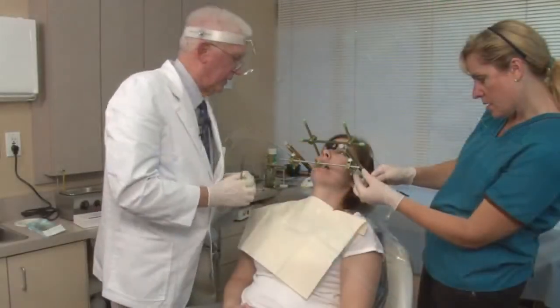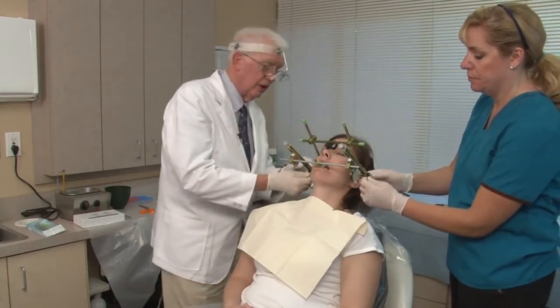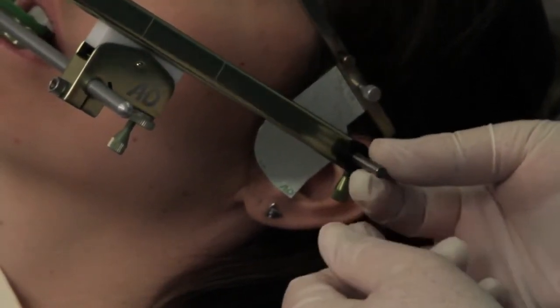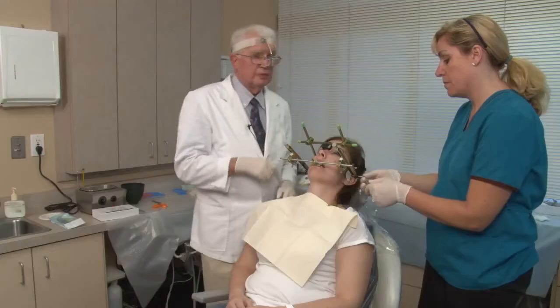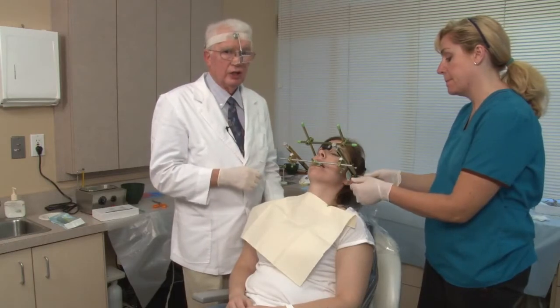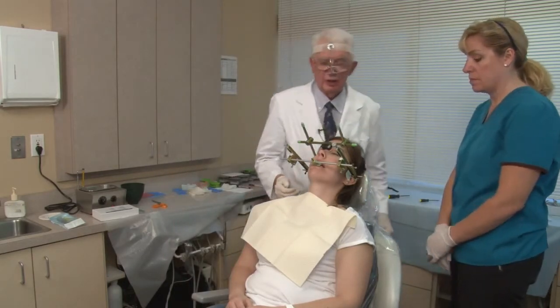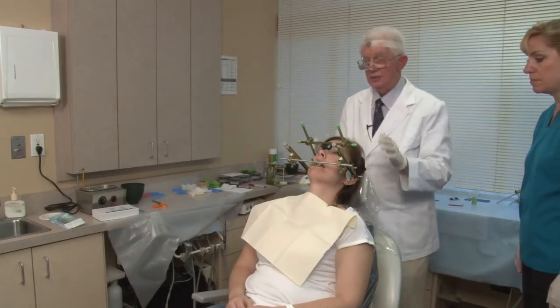That's good. Now, release the stylus pen, that is that one. Release the stylus pen. Take it out, turn and put the point toward the flag. But don't lock it. Just leave it loose. Always be careful with the stylus pens. You don't want to drop them, especially onto a linoleum floor, because if you bend the point of the pen, you'll never locate the hinge axis. So you have to be very careful with the stylus pens.